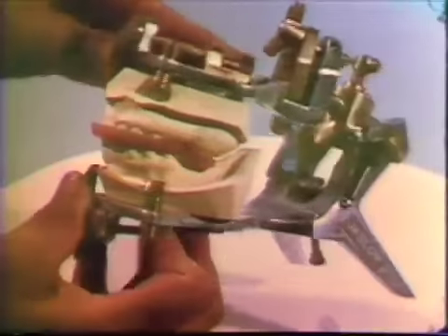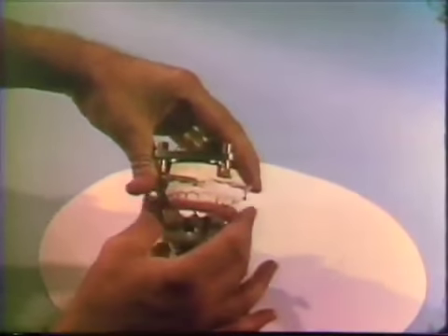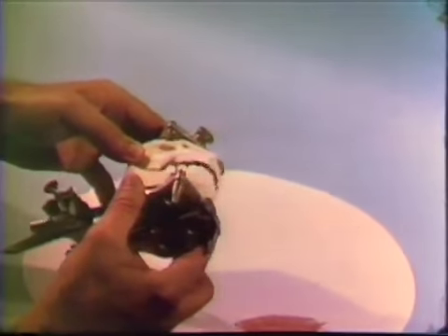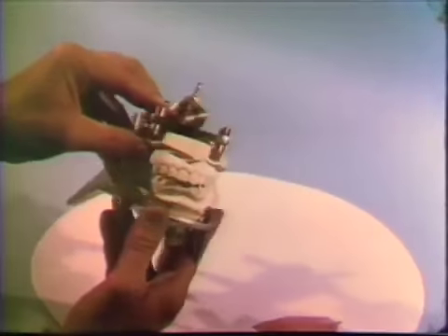Inter-occlusal relationships can best be evaluated when the study models are mounted on an articulator. A suitable articulator for this procedure is one that will allow a centric mounting with some freedom to develop eccentric excursions. A plasterless articulator of the Galletti type is very useful for mounting study casts. Information which is achieved on the mounted study models and correlated with information from the oral examination will lead to the development of the diagnosis and the proper treatment plan.